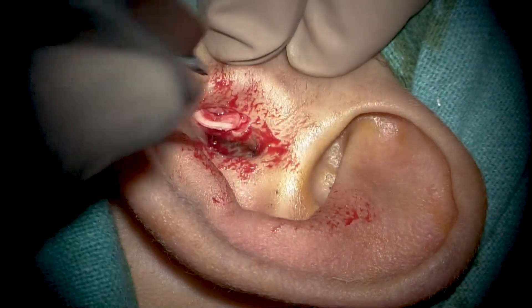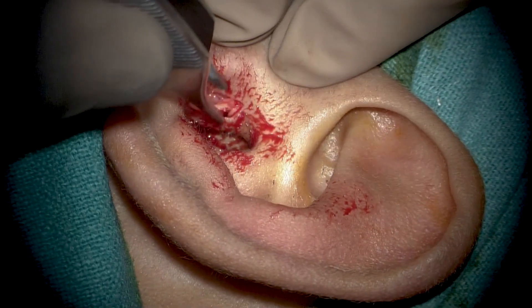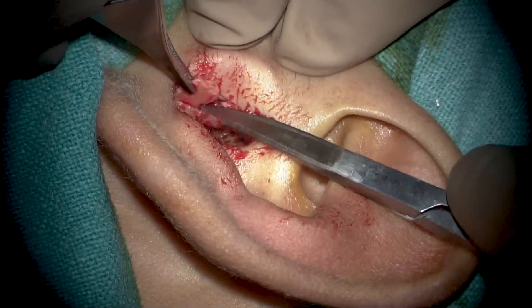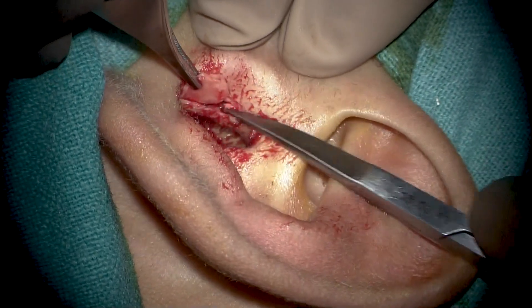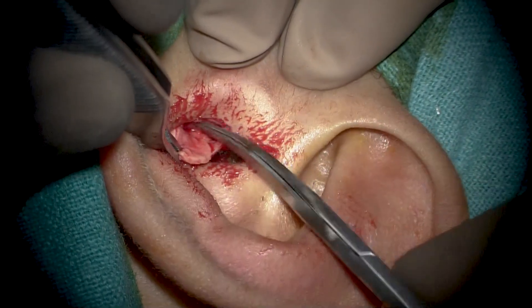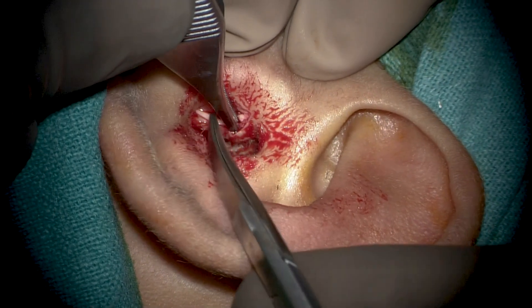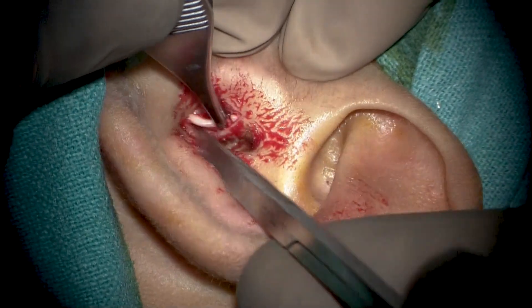For this part of the procedure, the choice of tragal cartilage is because of the transcanal nature of the surgery — it is accessible in the same operative field. However, if operating post-auricularly, one could also consider harvesting the conchal cartilage, which is logical in that situation.